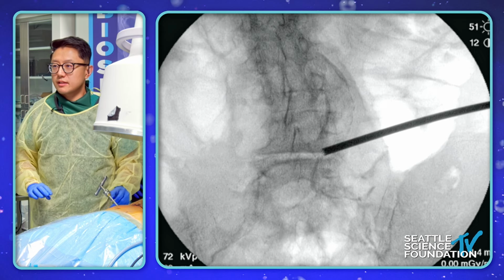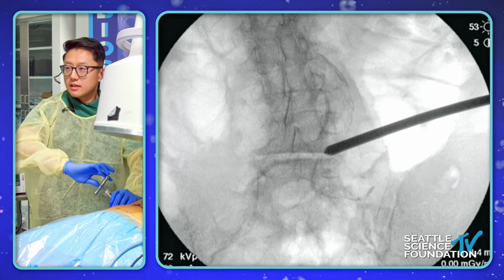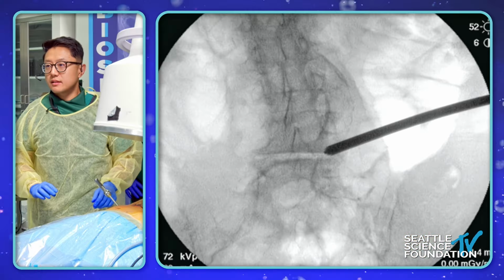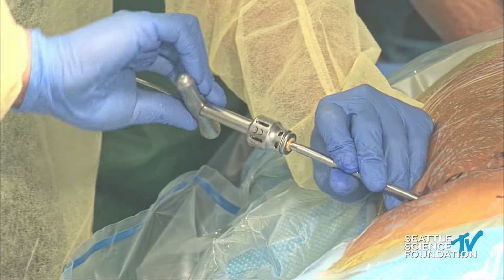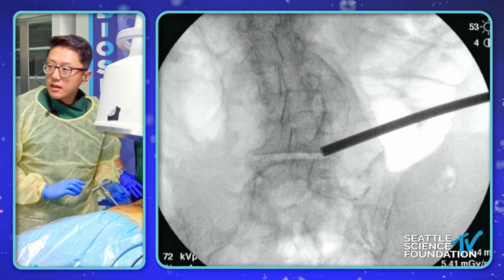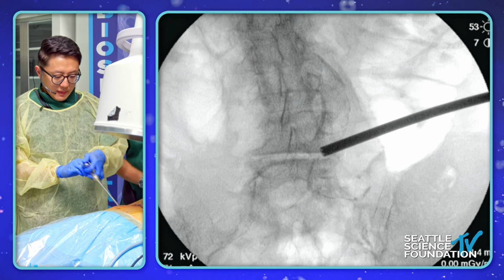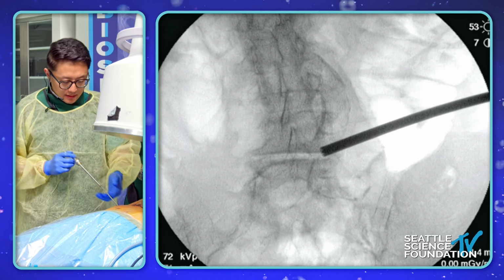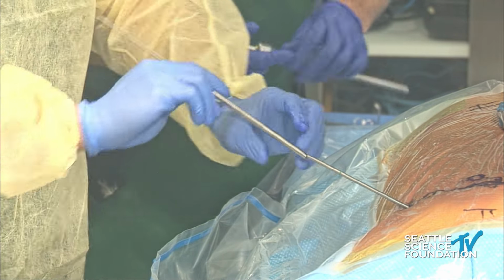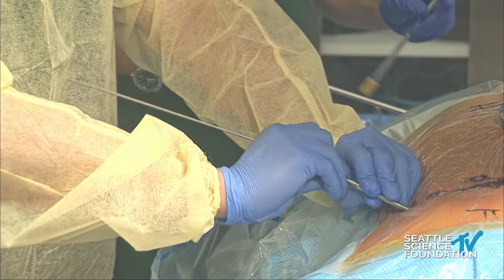So let's take another shot there. Let's see another shot there. One more shot. Okay, great. Now we're going to go up to the final dilator, and then we'll get the final reamer.